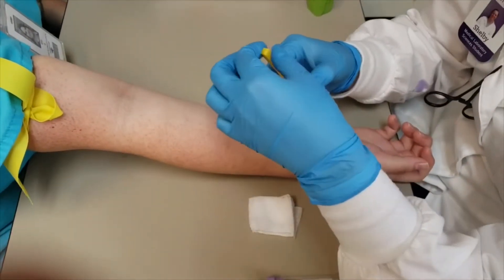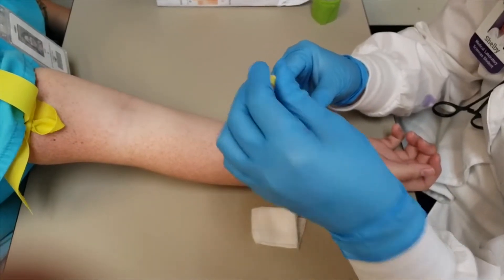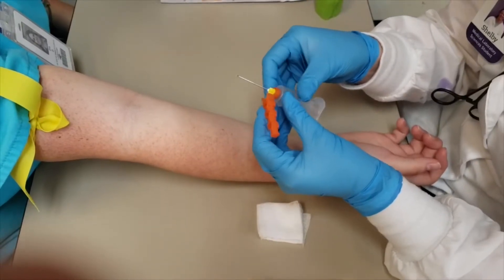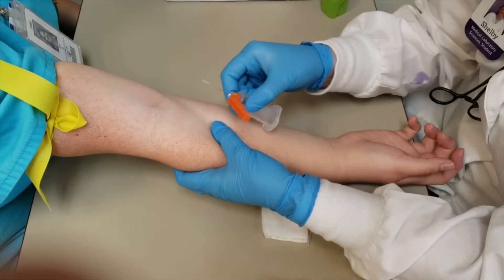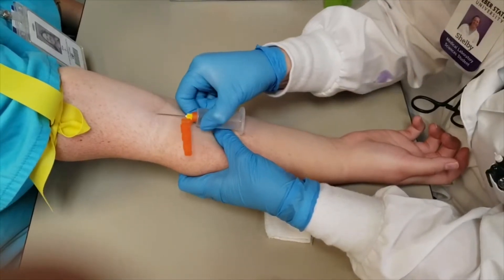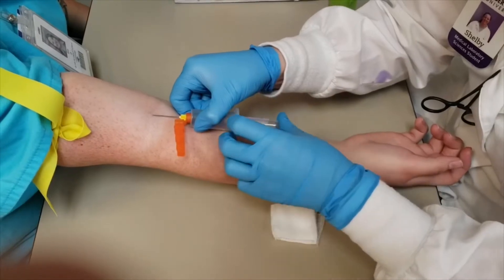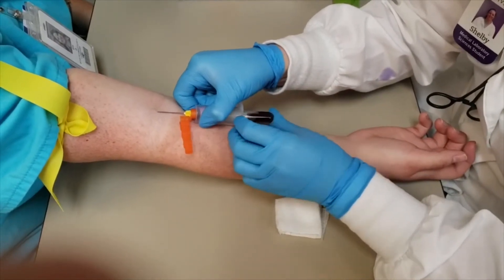Before you take this cap off, make sure you're slow and careful so you don't hit yourself with a needle. You're going to make sure that the bevel is up facing you, and you're going to anchor with your thumb so you make sure the vein is stable. And then you just put the needle in. You're going to grab your tube and slowly put the tube in the hub so that you don't push the needle back into the patient.